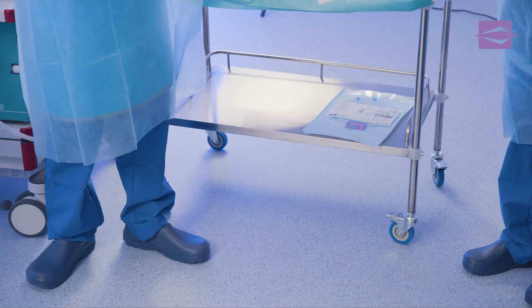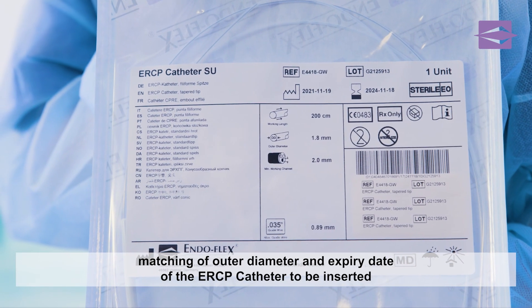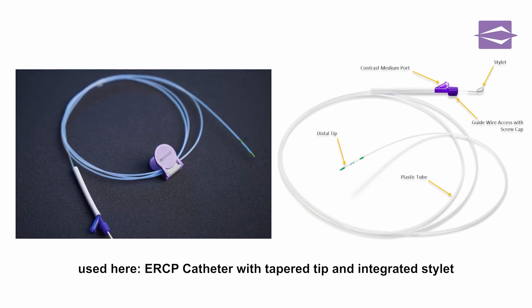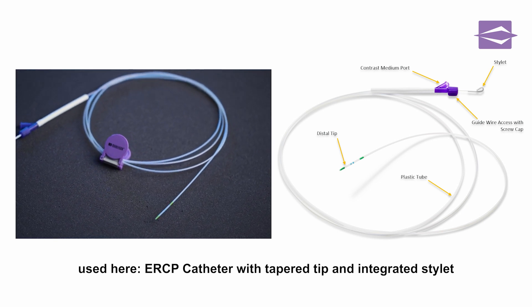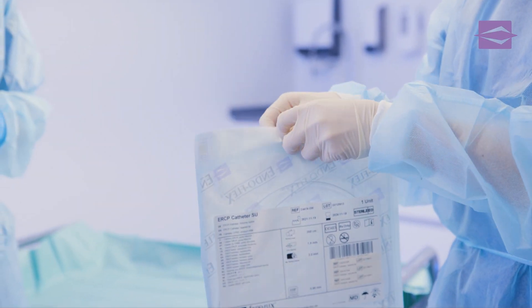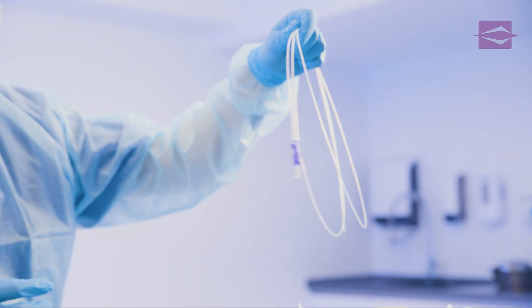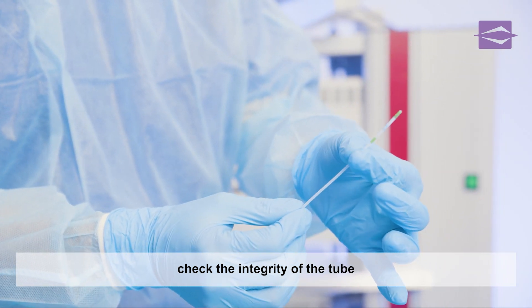After positioning of the duodenoscope, the previously selected ERCP catheter is handed over. The assistant compares the outer diameter of the catheter and the sterility expiration date with the label on the pouch. In this demonstration, we use an ERCP catheter with a tapered tip and integrated stylet for stabilization. After the data has been compared, the assistant removes the catheter from the sterile packaging. Before insertion into the working channel, the tube of the ERCP catheter is examined for potential damage and deformation.